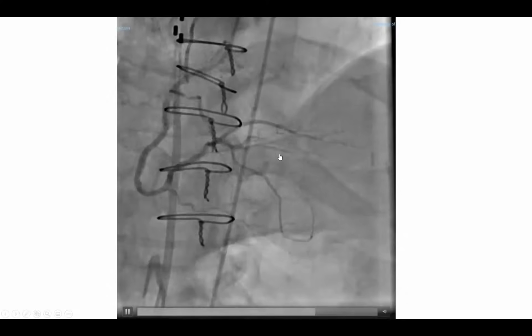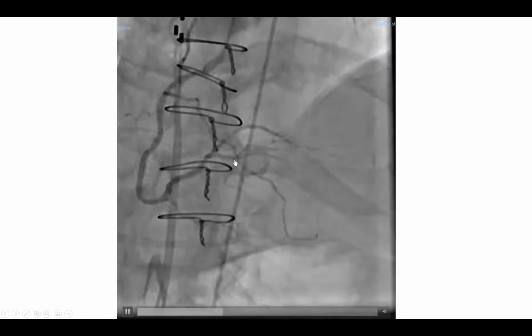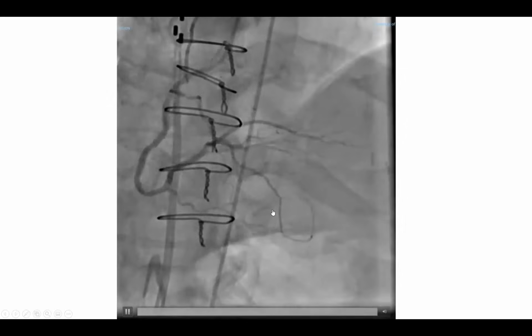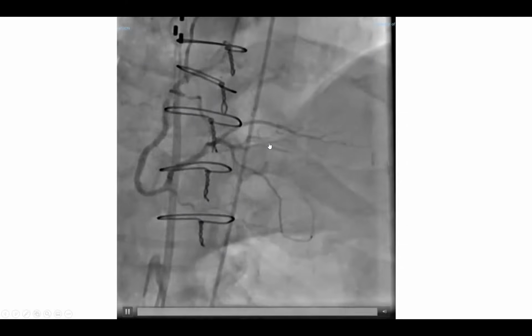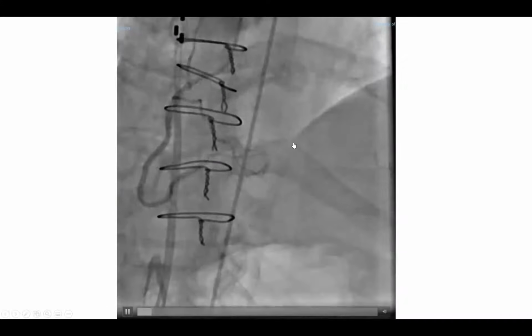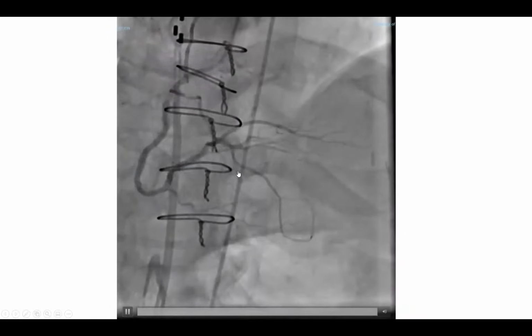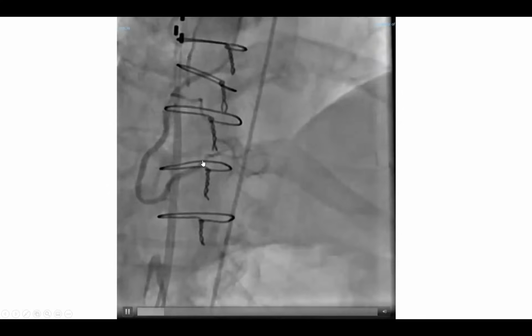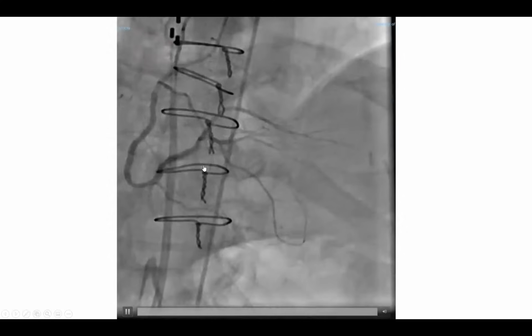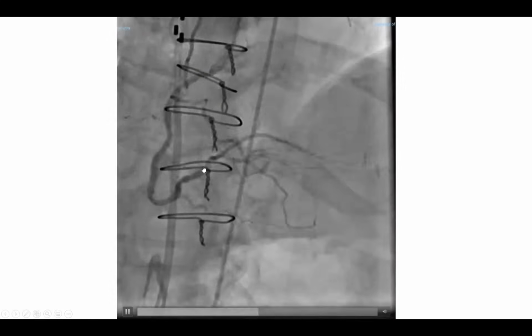I did not think that's most likely for a couple of reasons. One, those branches you see are too small to be bypassed. They don't extend beyond half of the heart margin, or beyond half of the LV length. So those are most likely small posterolateral branches. Most likely those are not the bypassed vessel, the bypassed PDA. Probably there is a PDA here that is longer that is being bypassed and that is occluded and disconnected from the native RCA. Most likely.